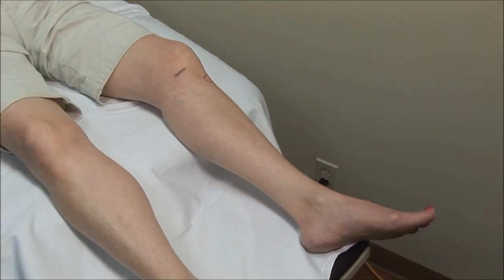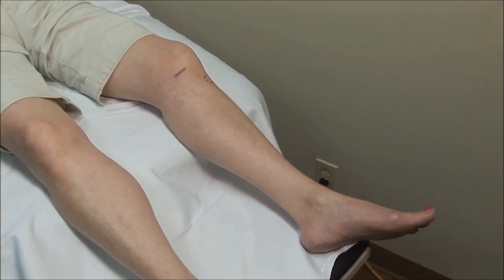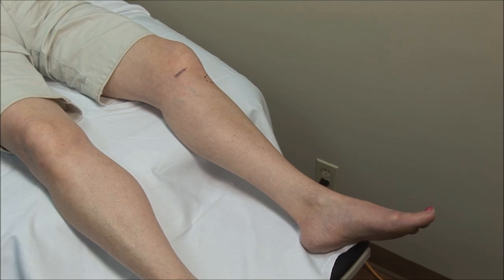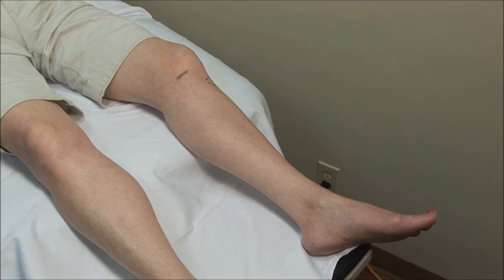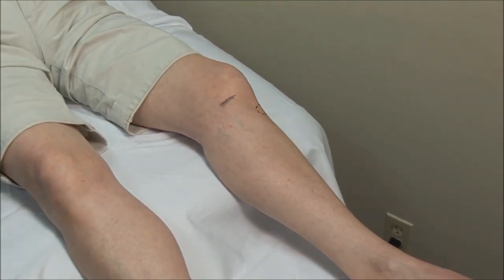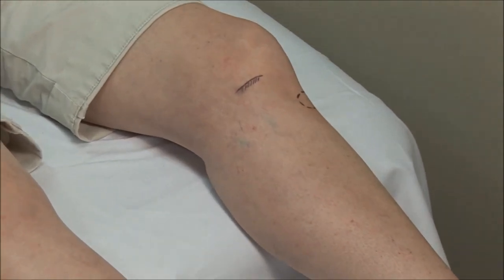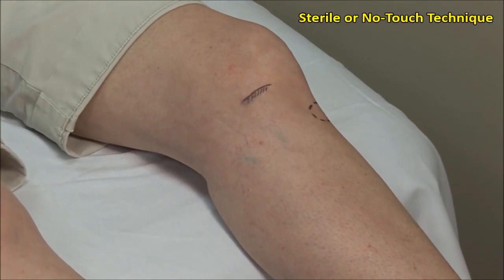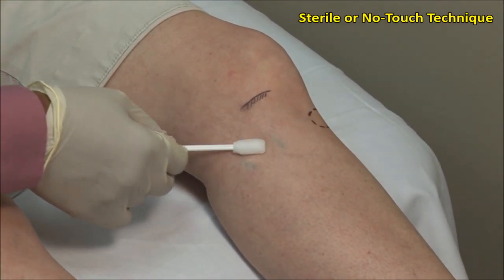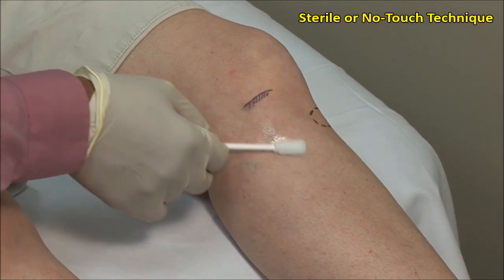Injections of the anserine bursa are done with the knee slightly flexed and the leg externally rotated a little. These injections should always be done using sterile technique. Scrub the site and then clean in an outward fashion.